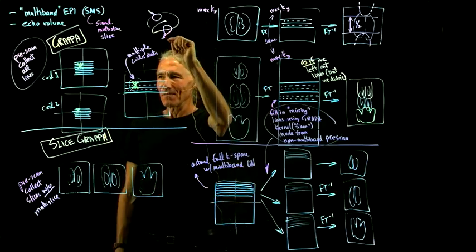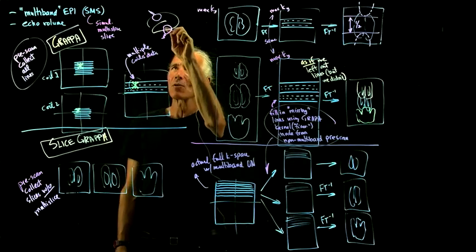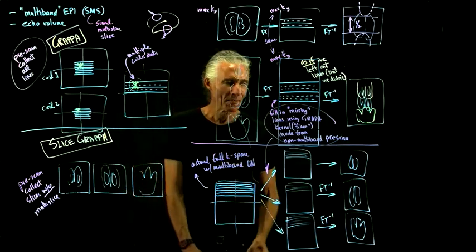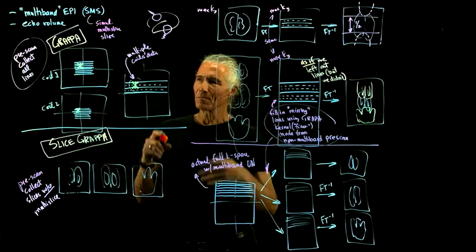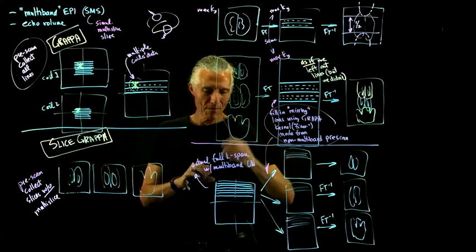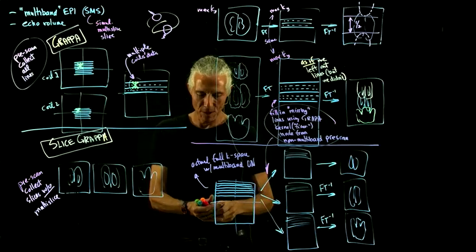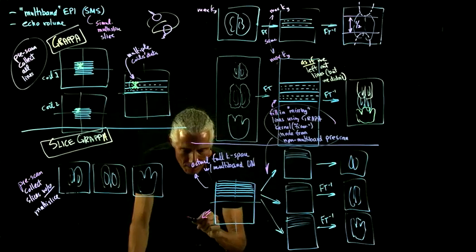But this doesn't really give you a concrete way for how that spatial information from each coil could actually be used. And this is how it's actually done. You excite multiple slices. You try to separate them a little bit with the Z blips, but they're still way overlapping. And then you take that one set of K-space data that you collected. Well, there's a version of this for every coil.